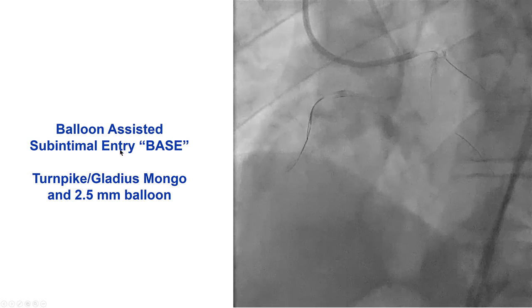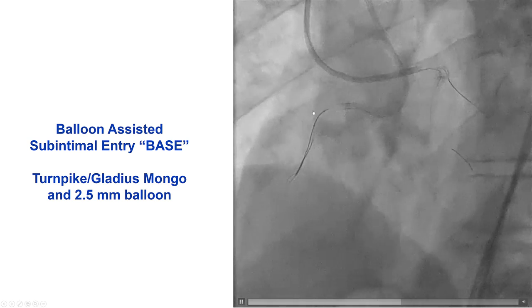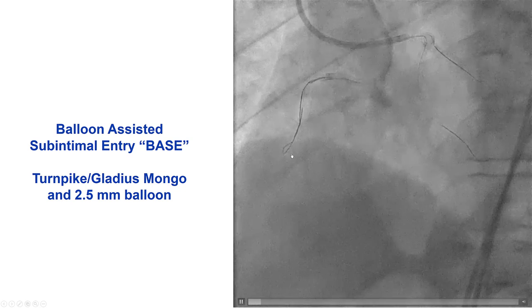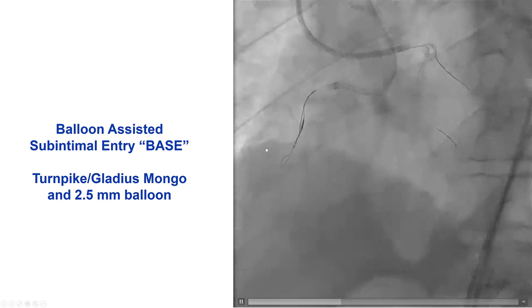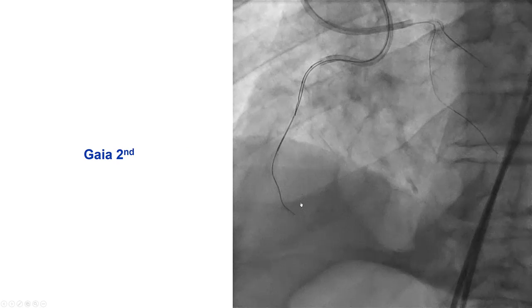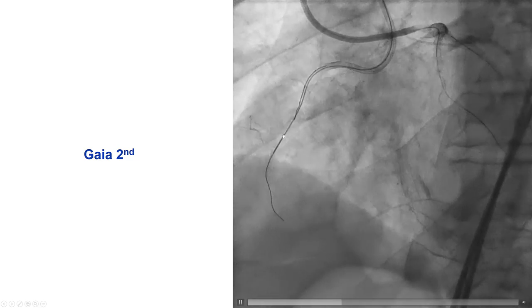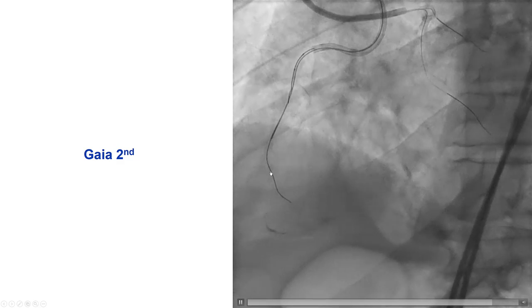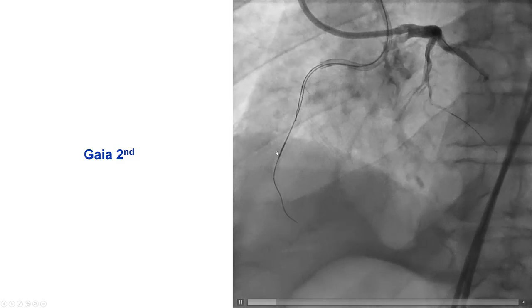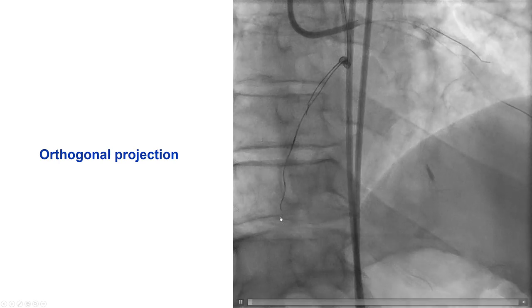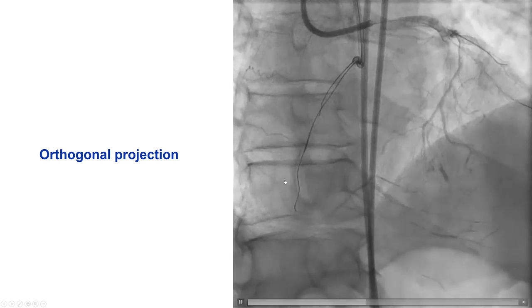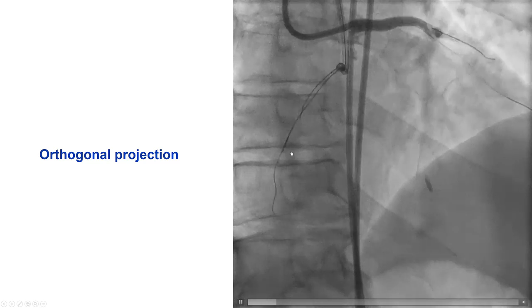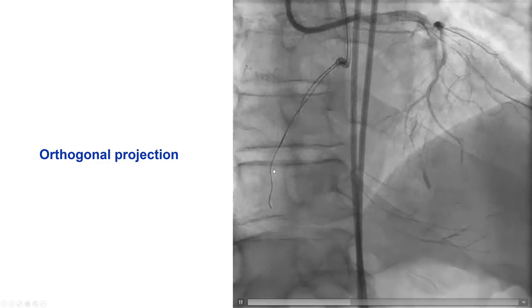We did the BASE technique — balloon-assisted subintimal entry — with a balloon inflated over a second guide wire in the proximal portion of the vessel. Eventually we were able to advance a Gladius Mongo wire that seemed to go along the course of the RCA. We could not deliver the microcatheter, but the Mongo was exchanged for a Gaia second. The contralateral injection demonstrated that we were dancing with the vessel, within the vessel architecture. The orthogonal projection clearly showed we were moving with the vessel but in the extra-plaque space, not the true lumen.